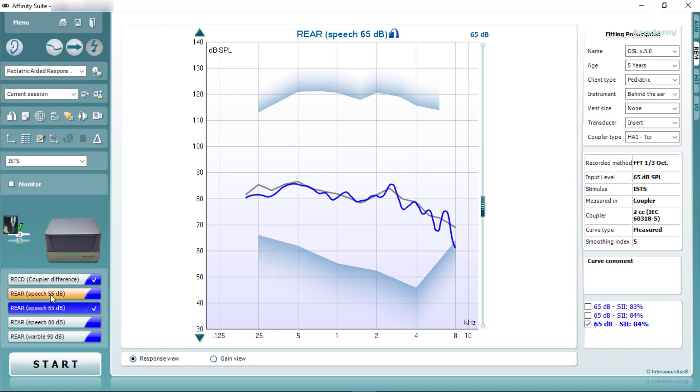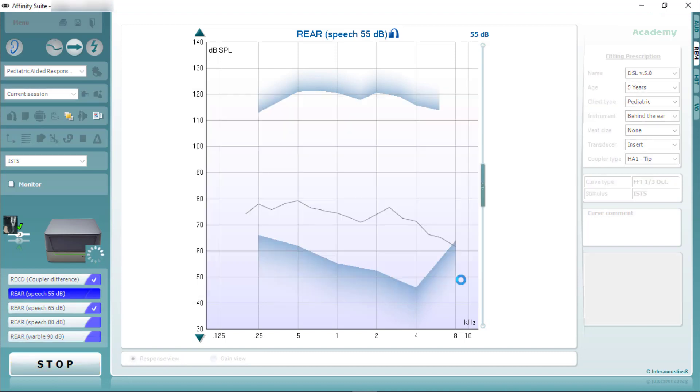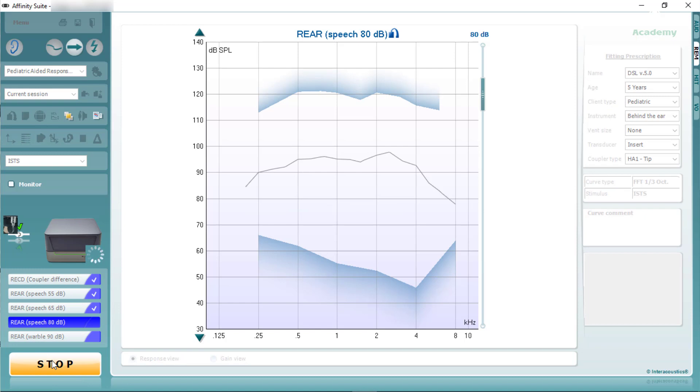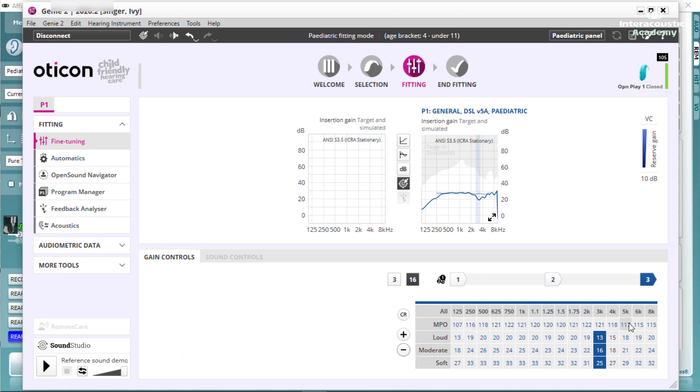Once we're happy with our verification at 65, we can move on to verify at 55. This represents the softer components of speech. Once 55 has been verified, we can move on to present a loud intensity at a level of 80. Once we're happy with a level of 80, we can move on to run a sweep at 90. This ensures that we can check that the hearing aid doesn't exceed the patient's uncomfortable loudness levels.